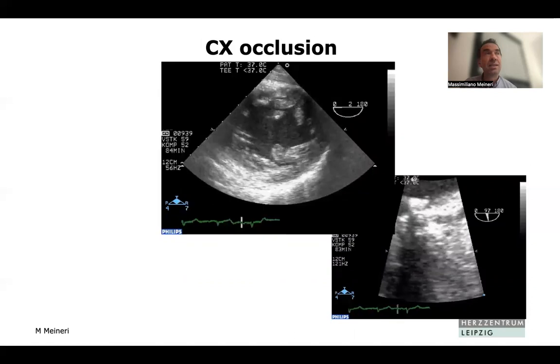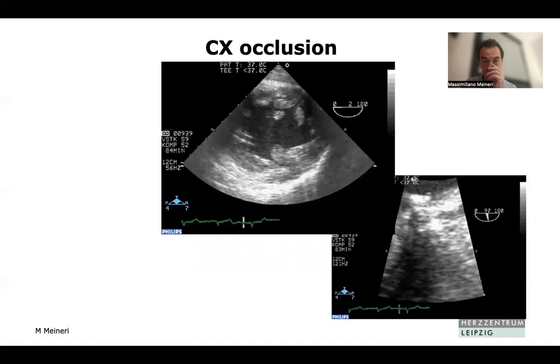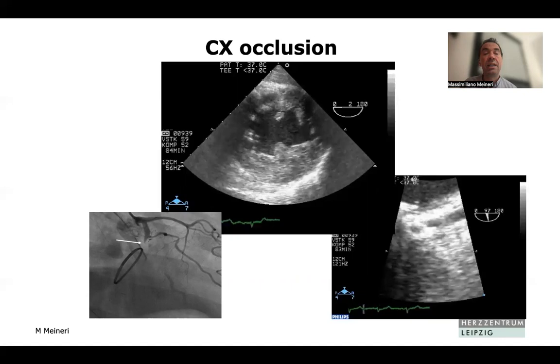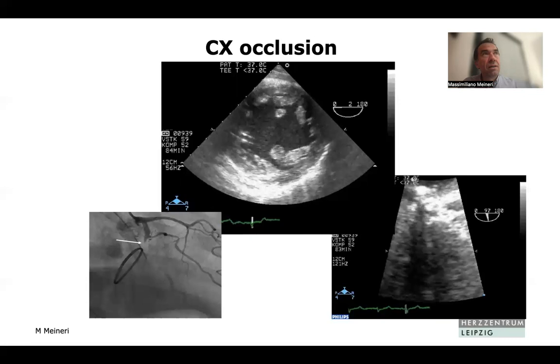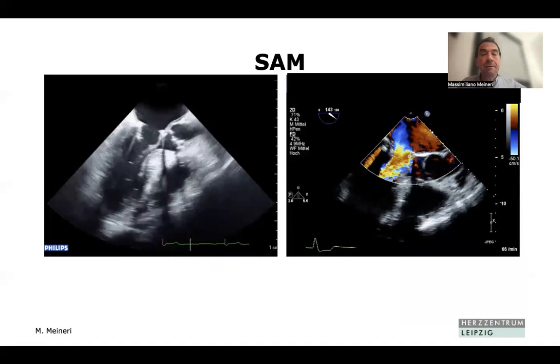Circumflex artery occlusion does happen. It presents with lack of flow in the coronary artery and an obvious wall motion abnormality in the lateral wall. This was a patient who went directly from the OR to the cath lab. Even in a high-volume center, this still occurs once or twice a year.